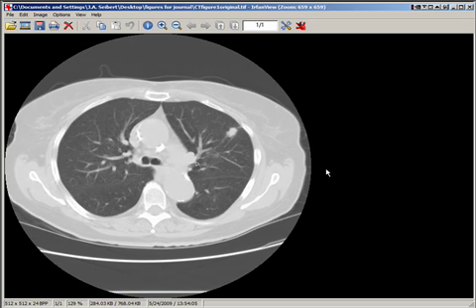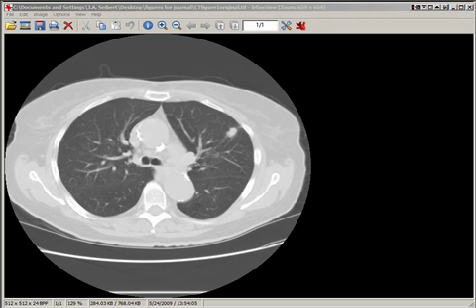I want to draw your attention to the lower left-hand corner of the IrfanView main screen, which indicates the pixel dimensions, the matrix size, and the number of bits per pixel. For this image, there are 3 bytes, or 24 bits of information, or 8 bits for each red, green, and blue intensity that convey the color data.